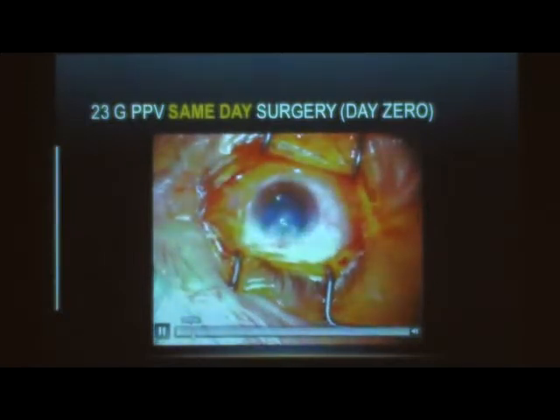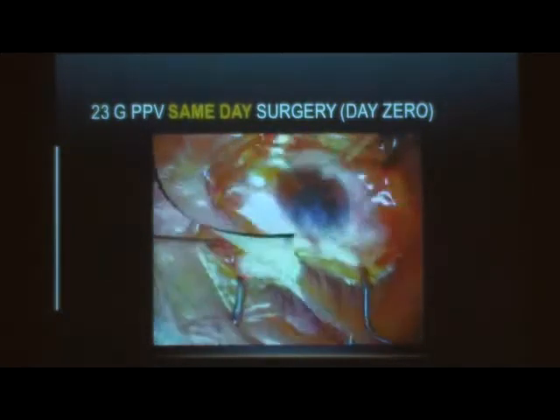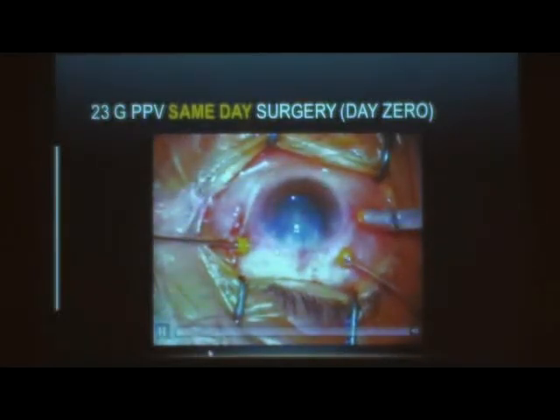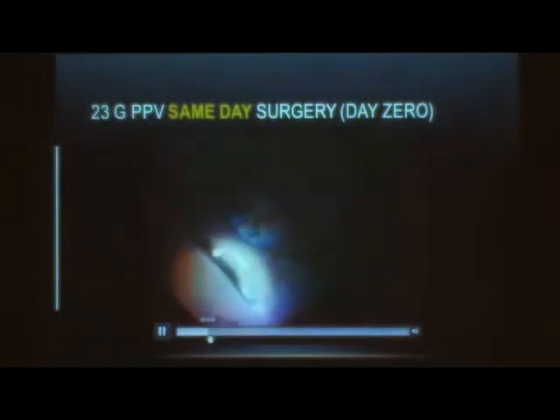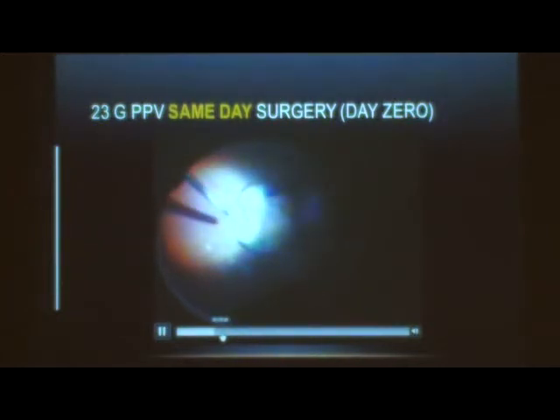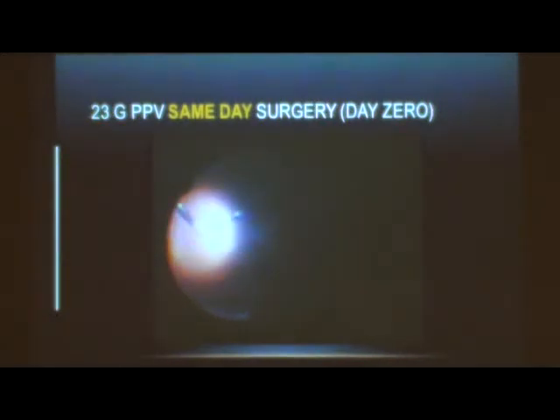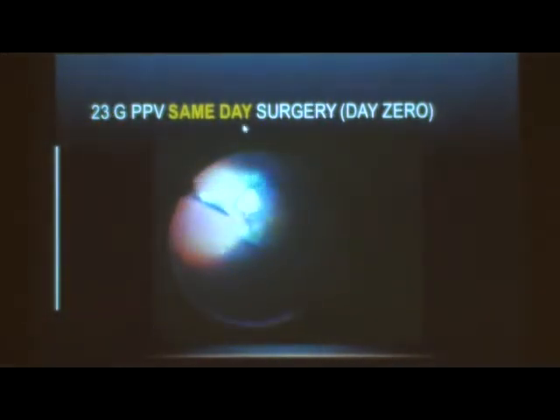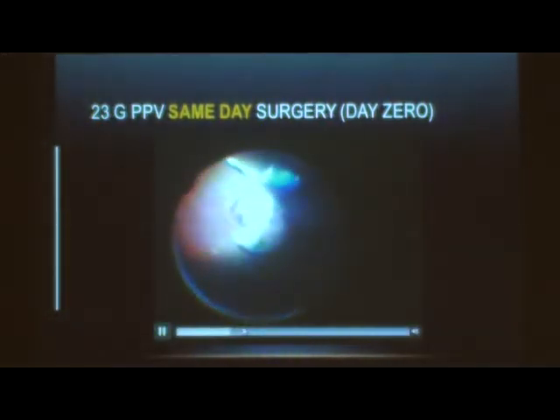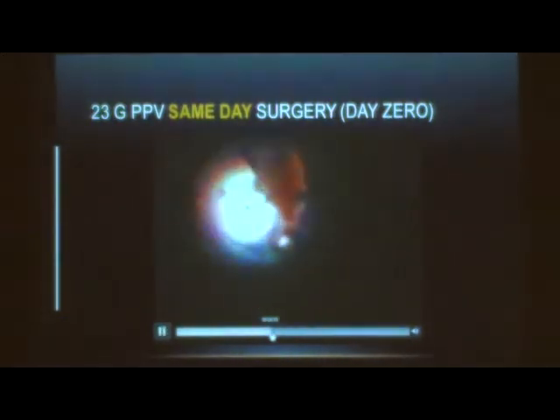Okay, so the cataract surgeon was working in the next room to me, and then he said that I have a dropped nuclear fragment. Again, this was just 1 hour after the cataract surgery. Once he just divided the nucleus, it dropped at the back of the eye. Again, he managed the case professionally. He did an anterior vitrectomy and put a sulcus 3-piece IOL. All my job is to go at the back without violating the vitreous from his part.